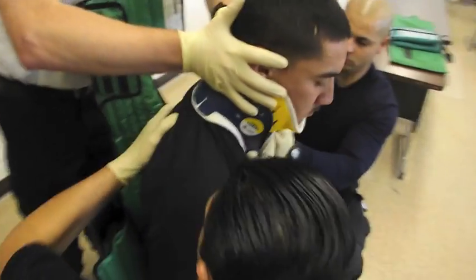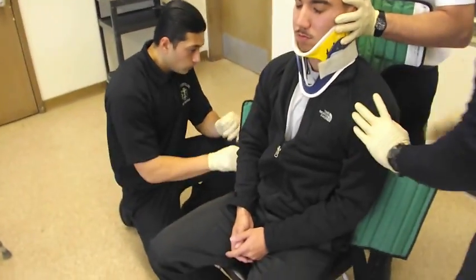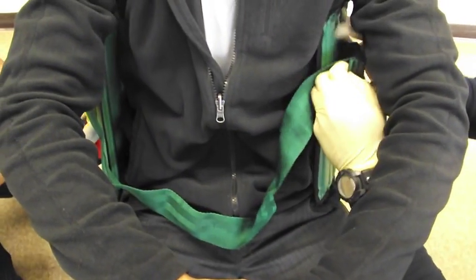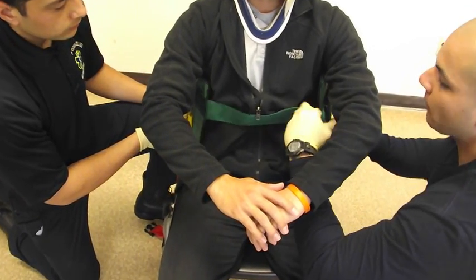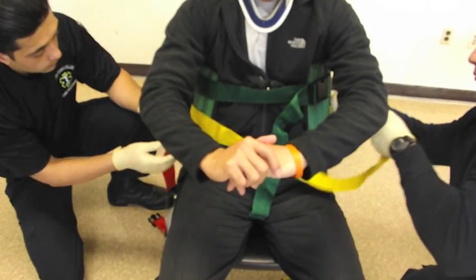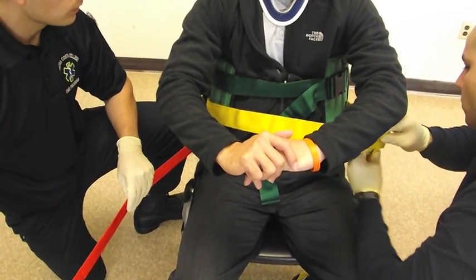I'm going to lean back into the KED on my count. One, two, three. Now we'll start from top to bottom with the green strap and pull it all the way across. They're going to use the cross-threading technique so as not to shift the patient's spine as they tighten this down — just snug, then move on to the next one. As they move down the straps, they'll get a long tail from the end of the clip, so the best thing to do is let that hang down and get trapped between the other straps so it won't be in the way later.